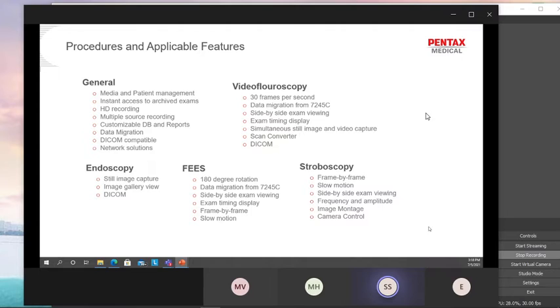I mentioned the stroboscopy data. If it's not showing, then you have to remember what I've told you just now: in the global environment, the stroboscopy data information may not be selected, so you have to check that it's being checked. Okay. And frequency, amplitude, image montage. Later I'll teach you guys how to do an image montage.